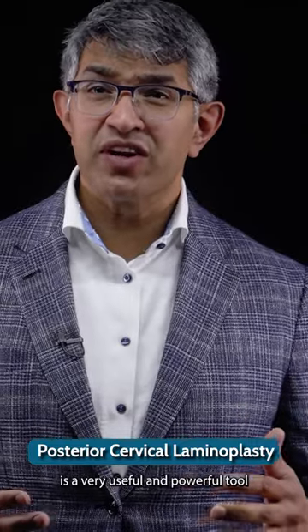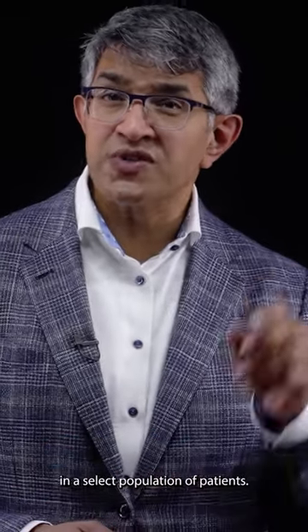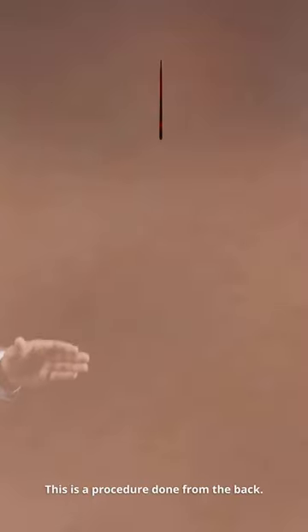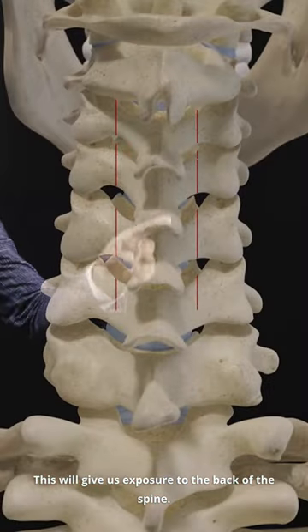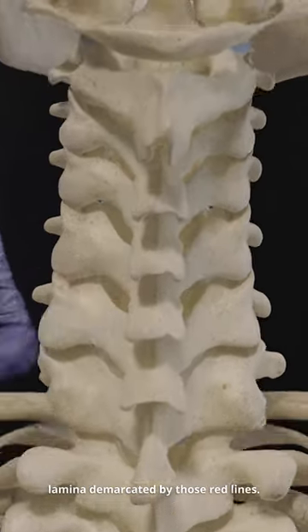The posterior cervical laminoplasty is a very useful and powerful tool in a select population of patients. This is a procedure done from the back, so the incision is usually in the midline up and down. This will give us exposure to the back of the spine, and you can see here the lamina demarcated by those red lines.